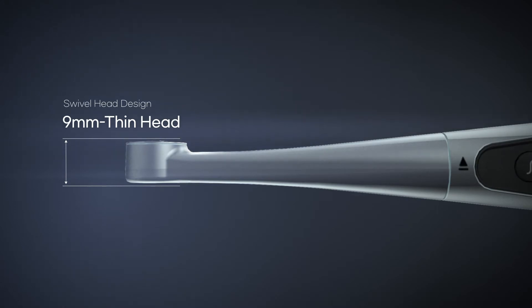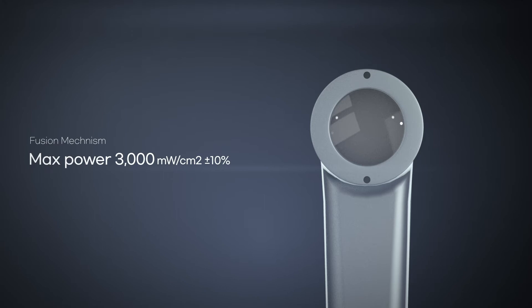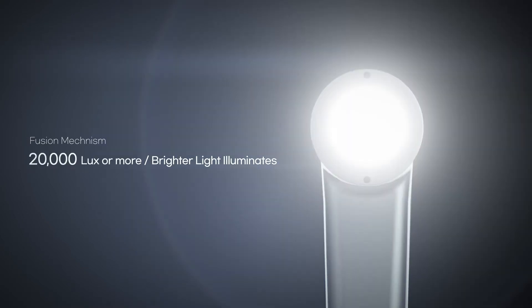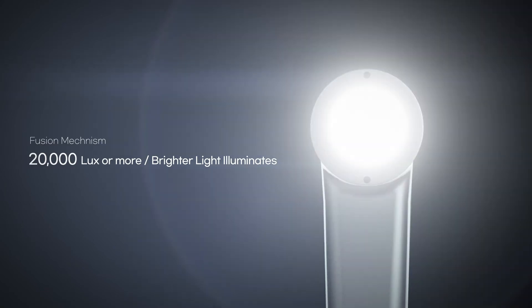It is comfortable for the patient and for the user. The curing light's max power of 3,000mW per square centimeter, plus or minus 10%, can polymerize the target quickly and efficiently. 20,000 lux white LED light illuminates the dark oral cavity to help find caries and cracks.